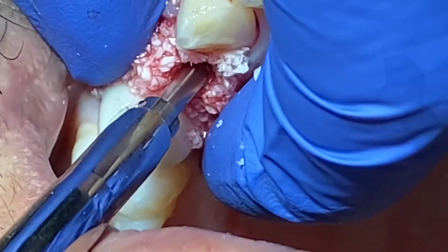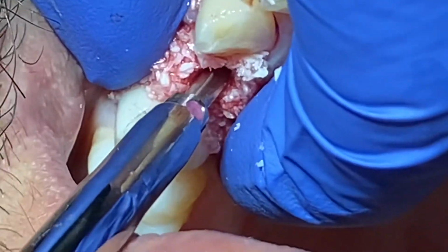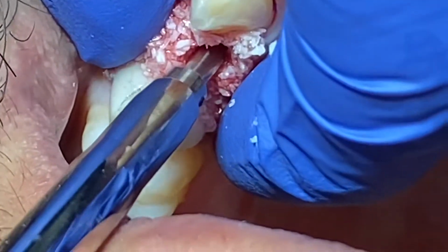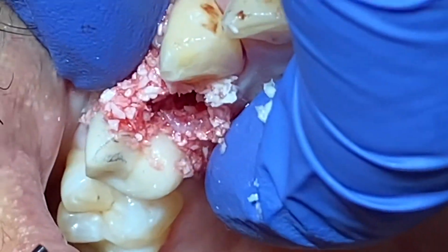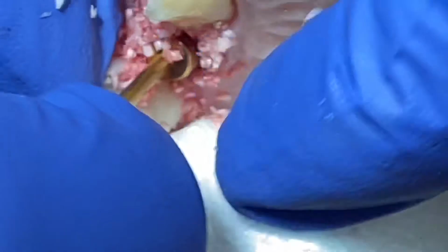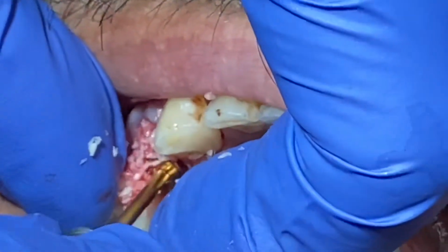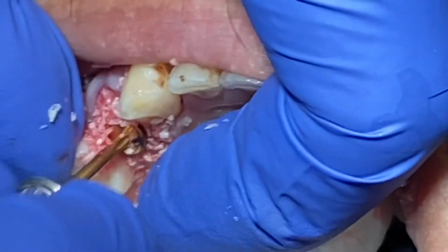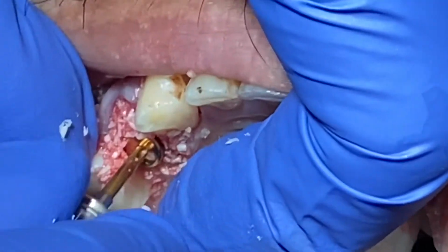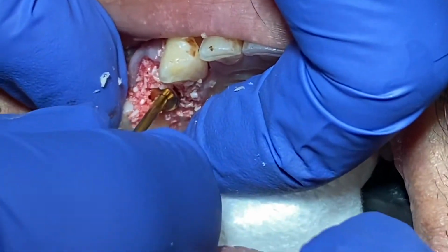So we took the tooth out, put the pilot drill right at the furcation area all the way down to the palatal angle. Placed the implant in with the hand torque right there and put the bone graft around this area. Put the healing abutment right now and try to establish the soft tissue formation for the patient. So now we finished the whole process of extraction, bone graft, implant, healing abutment.